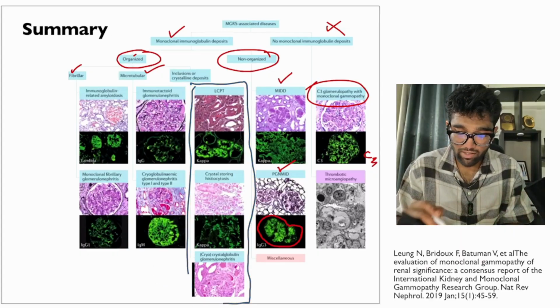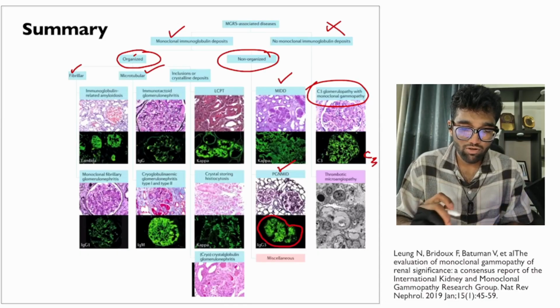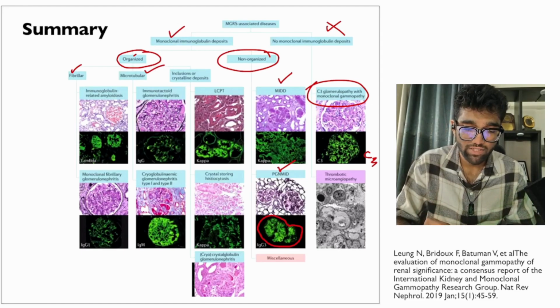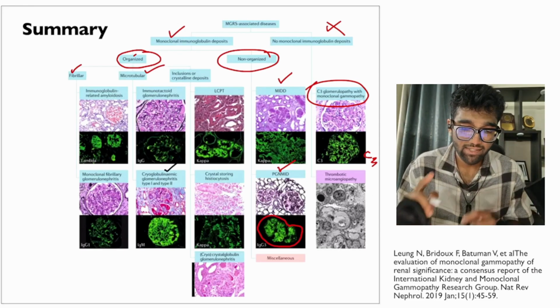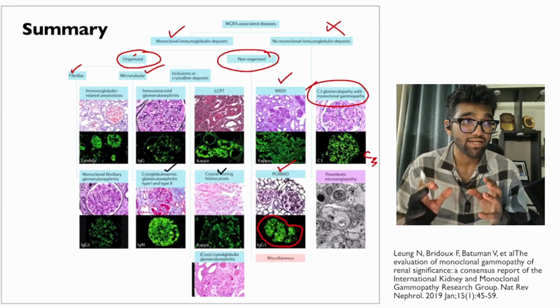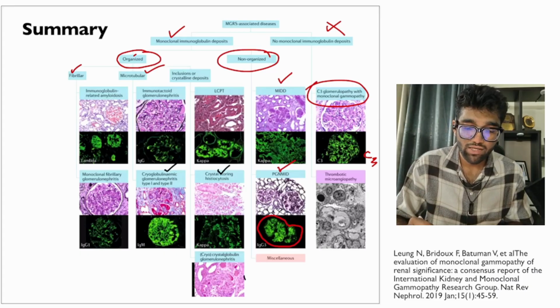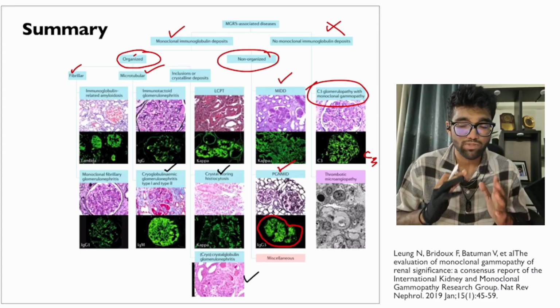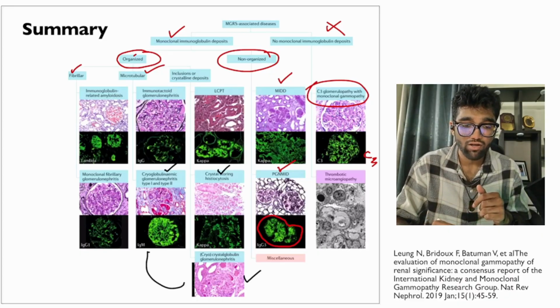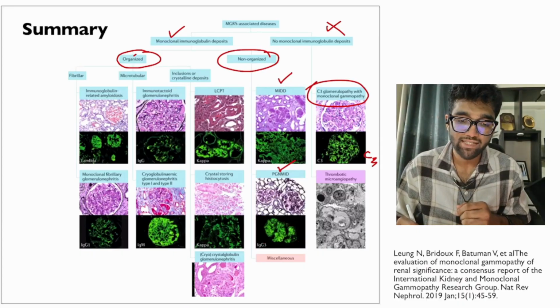Now, again, just to reiterate, very importantly, the entities here that can present with some systemic manifestations include obviously your cryoglobulinemic glomerulonephritis. They include crystal storing histiocytosis, in which case the predilection is for those organs that have a large resident population of histiocytes or dendritic cells. And it can include cryocrystalloglobulinemia or just crystalloglobulinemia, in which case the crystals deposit within the vessel and cause occlusion, mimicking your cryoglobulinic vasculitis. So that is your entire spectrum of MGRS.